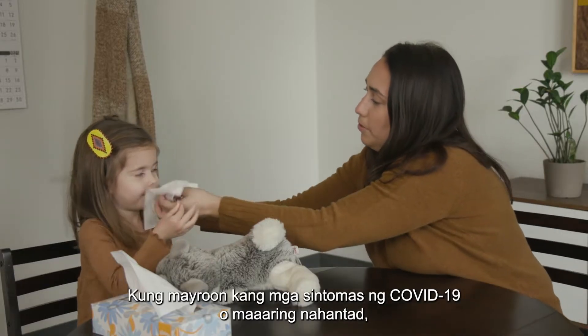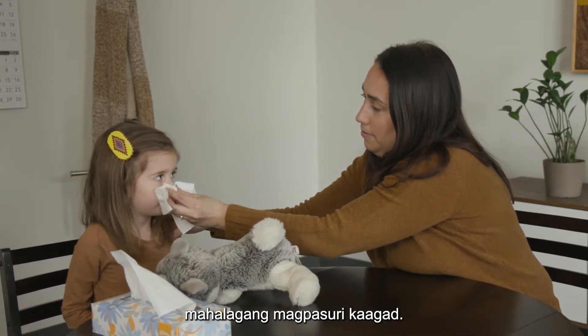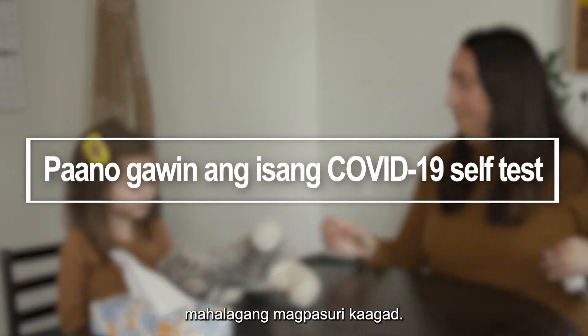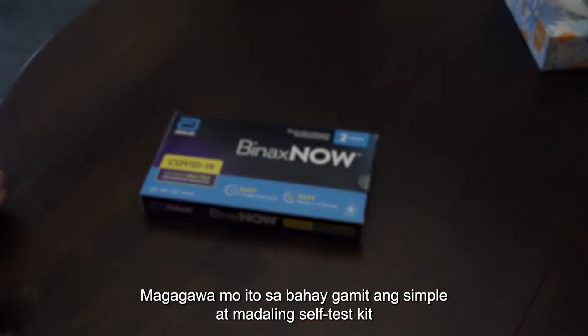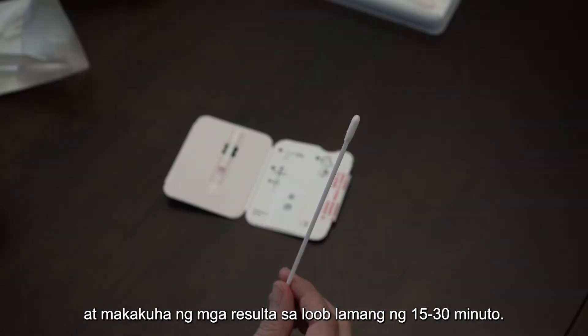If you have COVID-19 symptoms or may have been exposed, it's important to get tested right away. You can do this at home using a simple and easy self-test kit and get results in just 15 to 30 minutes.